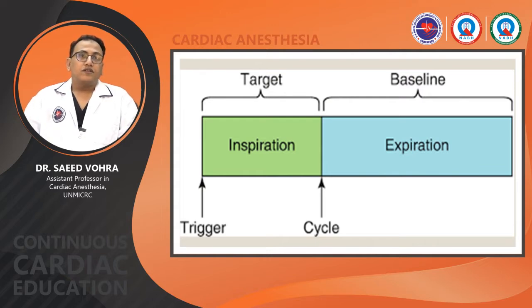Now, in this figure, this is a trigger which initiates the inspiration. Target dictates how the tidal volume is being delivered. Cycle is the termination of inspiration and beginning of expiration, and baseline is the proximal airway pressure during the expiration.